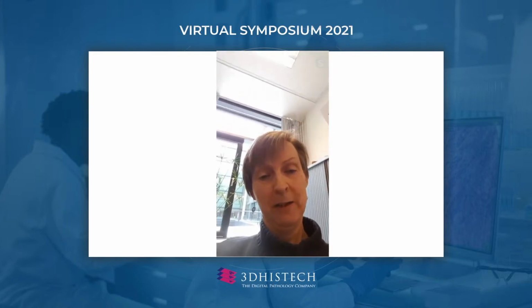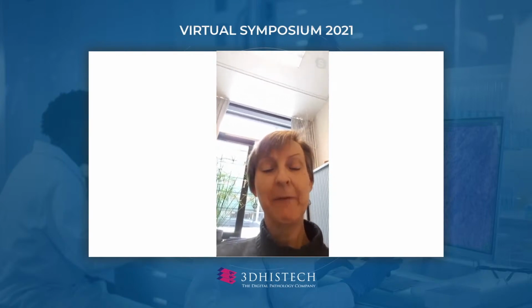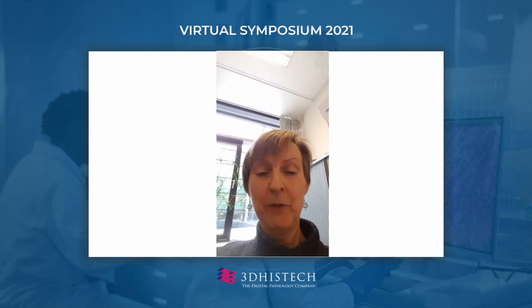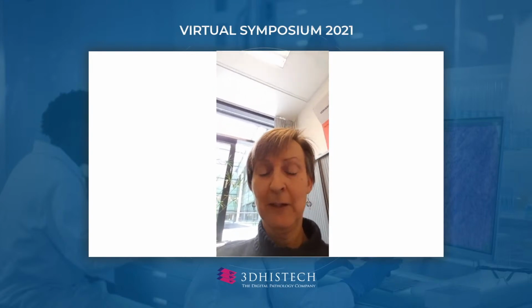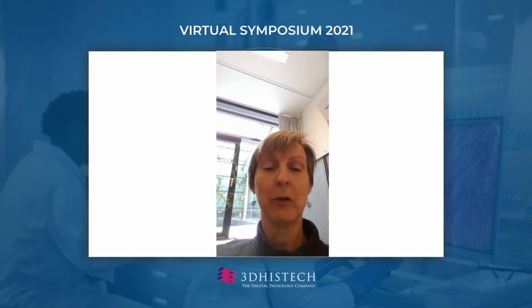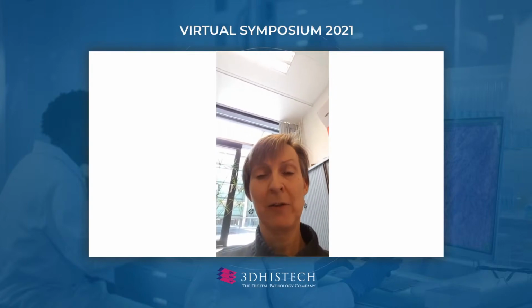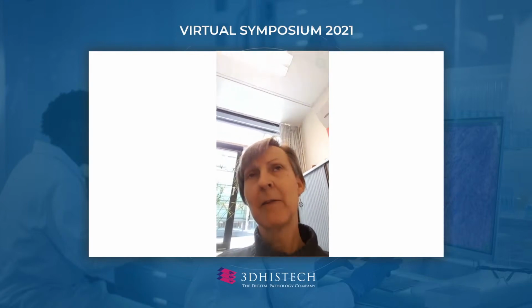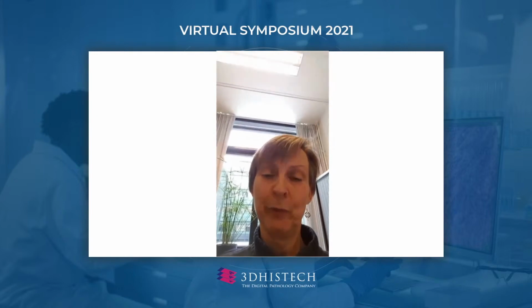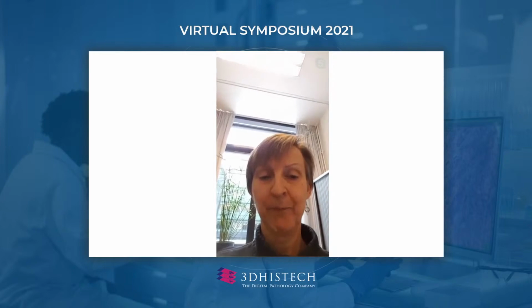The next question is about the quality control step, whether we have a trained histotechnologist or an engineer. Well, we have several histotechnologists who take turns during the day in doing the quality control, because it's very intense work, so you can't do this for the whole day. But I think one full technologist is needed for our caseload during the day to do this task.